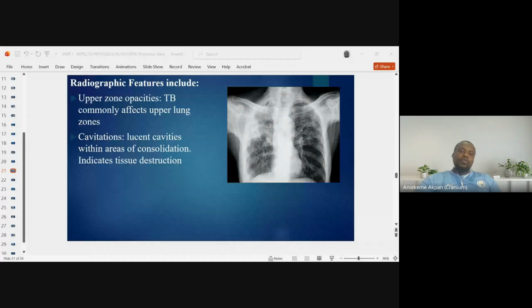All right. So tuberculosis is a chronic granulomatous infection caused by Mycobacterium tuberculosis, and it may produce cavitary or interstitial patterns. So you can see cavities, and these cavities are mostly caused by destruction of that particular area of the lungs, and mostly contributed by the body as well.